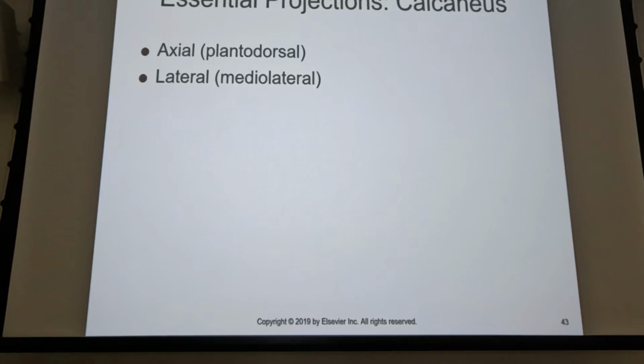Okay? So what you're going to find in a lot of these, extreme lower extremity, we want dorsiflexion of the foot. This one's going to be tough for you though. It's going to be tough for the patient anyway. And that is because if you look on page 311, you see that dorsiflexion, and it might require the patient to actually physically pull the foot back.